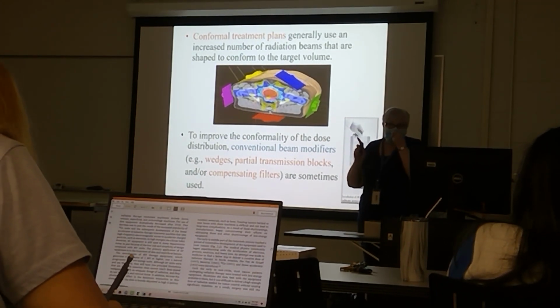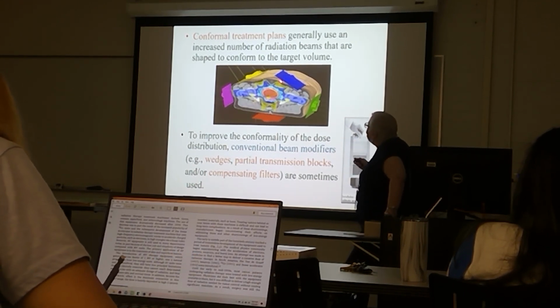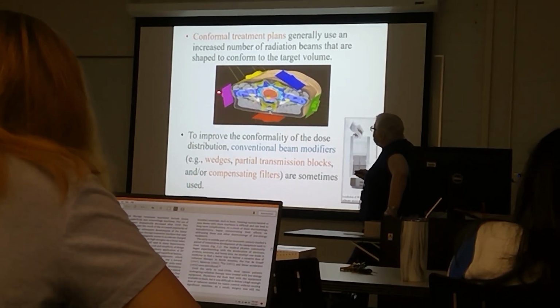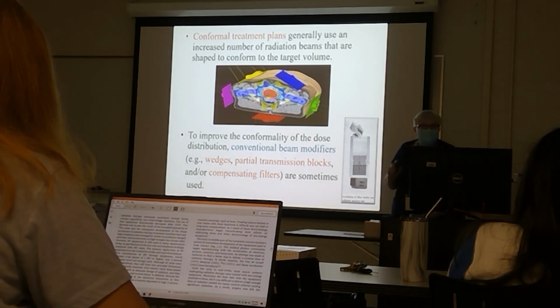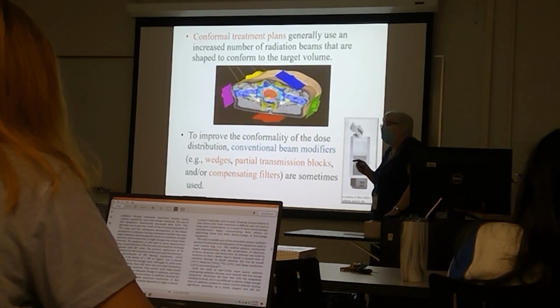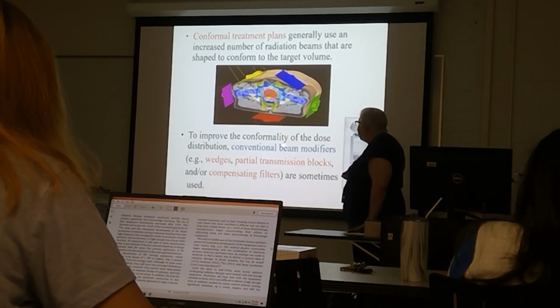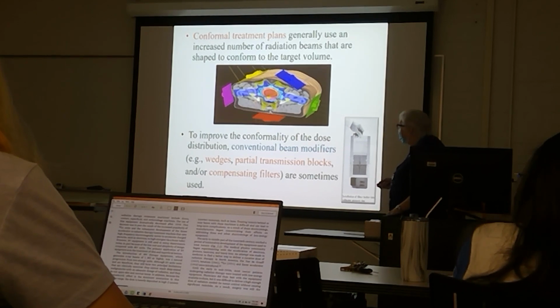Static fields, no arcs, just static. So you have shielding in each of these with MLC, but they wouldn't be moving. So improved conformity of the dose distribution.